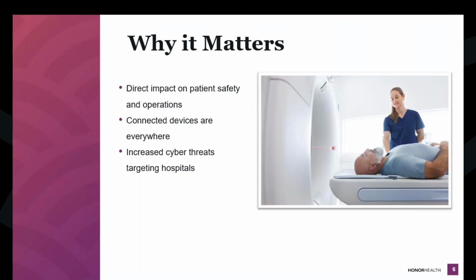Just to add to that too, cybersecurity is very important, but for example, Jen's in the back of the room there, we had a fiber cut for one of our hospitals. No patient monitoring anymore. Nothing that needed to be on the network could be on the network. So what's plan B, right? And so typically they'll rope in Biomed to say, how do we get this back? Well, what's Biomed going to do? Run fiber real quick? So I think that's important, not just the threat of it, but how do we keep patient safety via connected devices in general too?